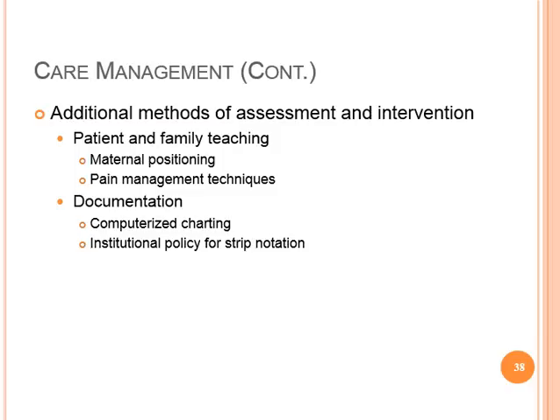Those hospitals that don't use electronic fetal monitoring or don't have computerized systems, they still will print out a physical fetal heart rate tracing strip, and they either will document everything on the monitor tracing, or they will document on the labor and delivery flow sheet.